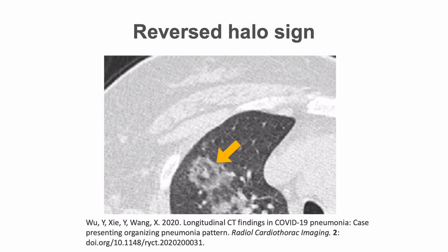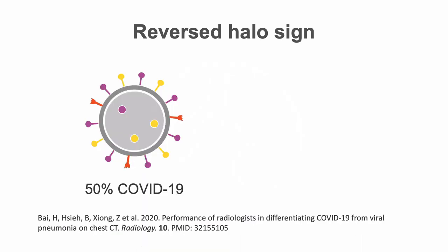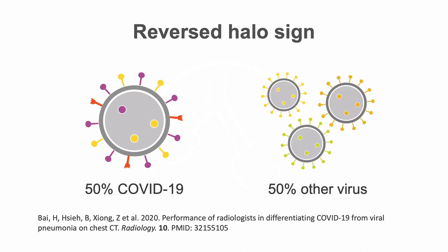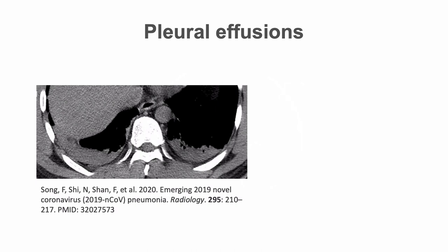The reversed halo sign, or atoll sign, is another finding reported in some patients with COVID-19. It reflects a peripheral dense consolidation surrounding a central, less dense ground glass appearance in the same region. This sign was mostly described in patients with organising pneumonia. Interestingly, in a study of over 400 cases — half with COVID-19 and the other half with other viral pneumonias — the reversed halo sign was found to be one of the differentiating signs seen mostly in patients with COVID-19 pneumonia.